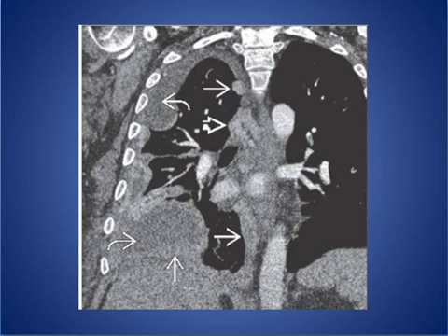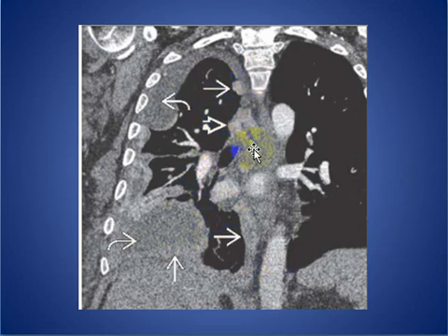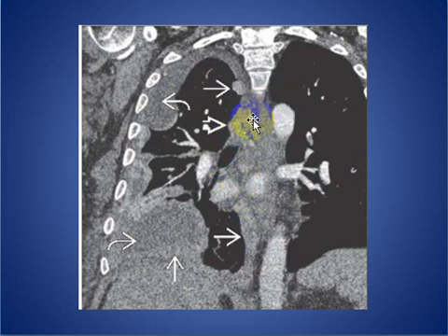Here we have a CT coronal scan with multiple metastases involving the pleura, associated with pleural effusion and lymphadenopathy in this patient from renal cell metastasis.